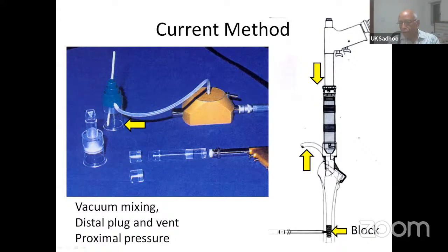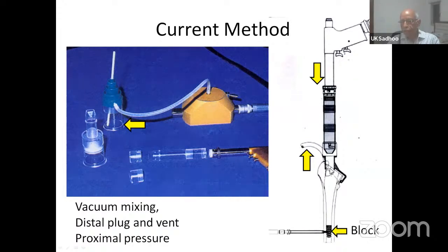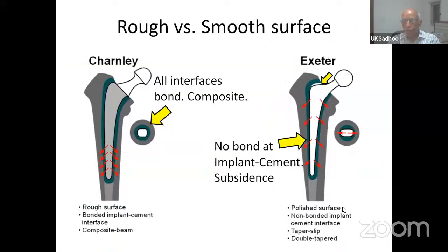Then you start pressurizing. Once you have put an adequate amount of cement there, there are ways and means of pressurizing this cement even more. And this vent, the suction catheter, takes all the collected blood that oozes out from distally, takes it out. It also sucks the semi-liquid cement right down to the end. So once you have this cement blob there, you put a thumb there and start putting that straight stem down the canal, blocking the escape of the cement from the medial side. So we'll go over all this in the video also.